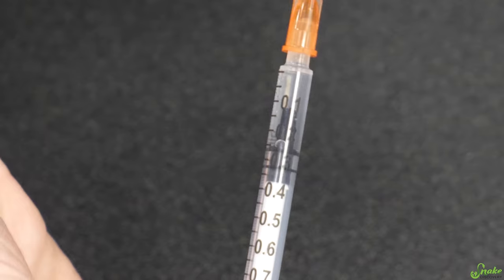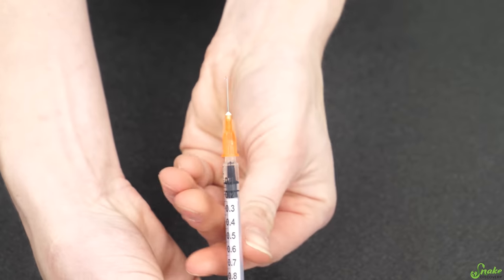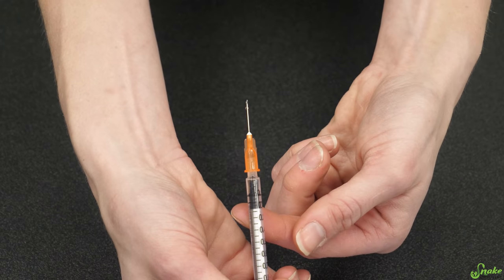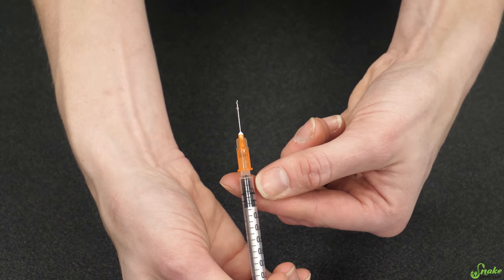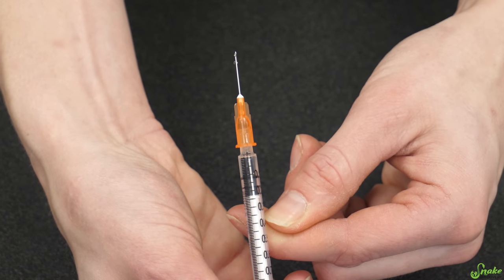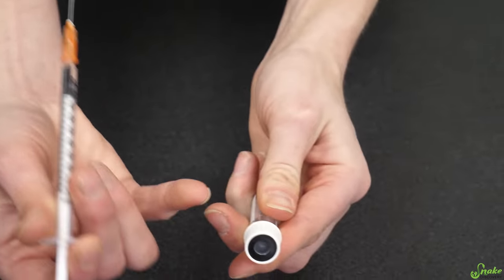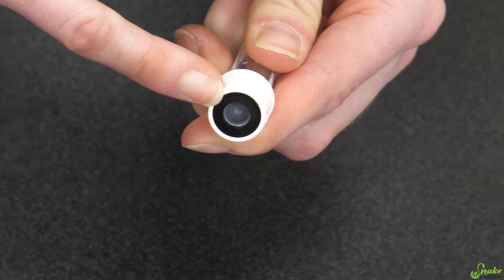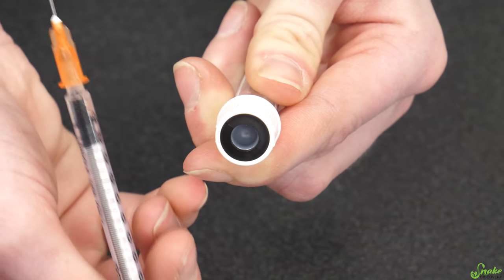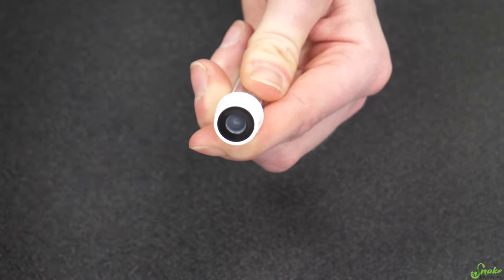We're going to go with 0.1 of this saline solution today. Pull it out, and we have our injection. If your vet gave you preloaded syringes, double check to see if they gave you the exact amount you need, or if they gave you a little extra so you can push out the excess and get the right amount. When you're pushing the needle into the vial, you're actually going to puncture through this membrane which keeps it sterile inside, assuming you're using a new needle each time. This will seal the vial again after you pull the needle out.